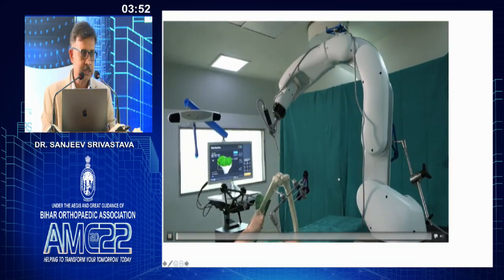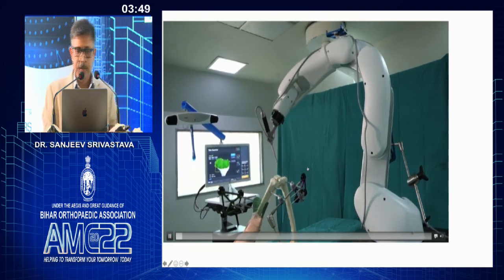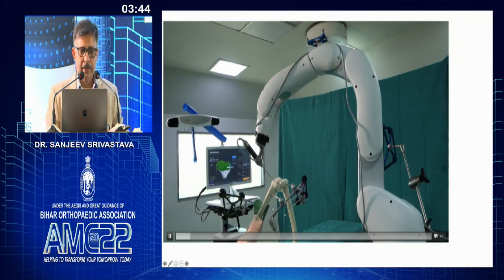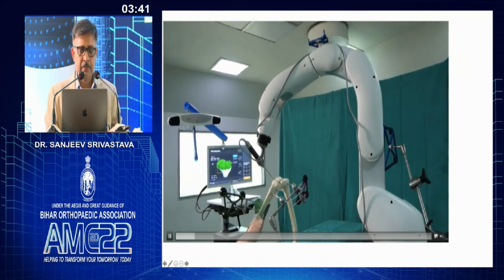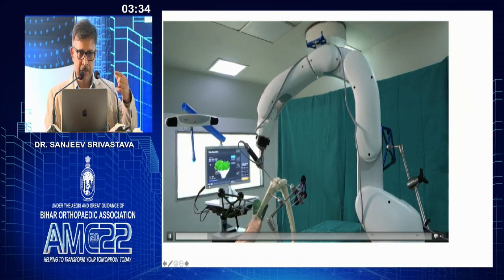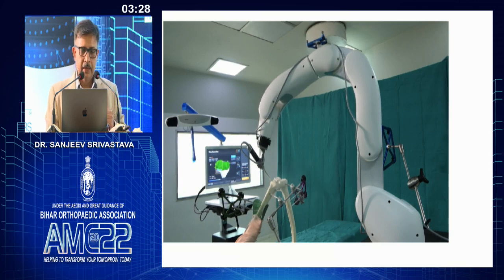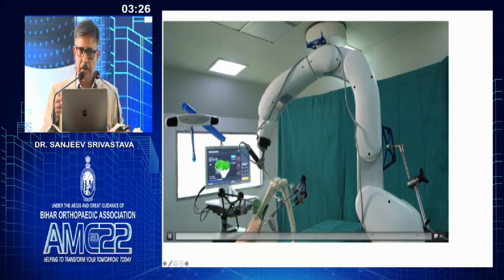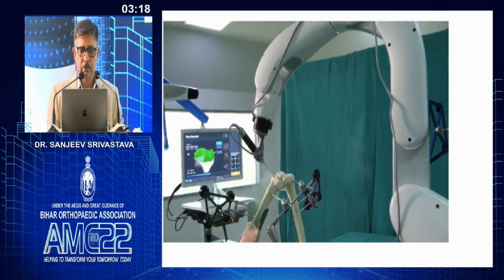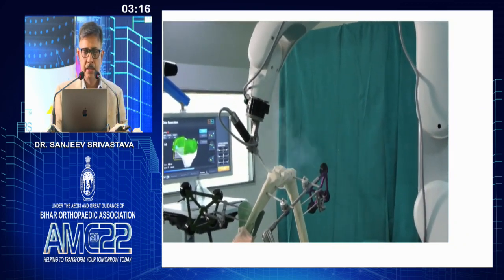It works autonomously, and it burrs, it tunnels through the bone and takes the cut. Okay, and while it is working, you can have a real-time picture of the portion it is cutting. So it is always coming from the medial aspect, from the anteromedial part of the arthrotomy. So you don't have to evert the patella. Okay, and it always leaves a ledge of bone on the posterolateral aspect, both on the femur as well as on the tibia. So the chances of soft tissue damage is almost nil. So that's how we do it.